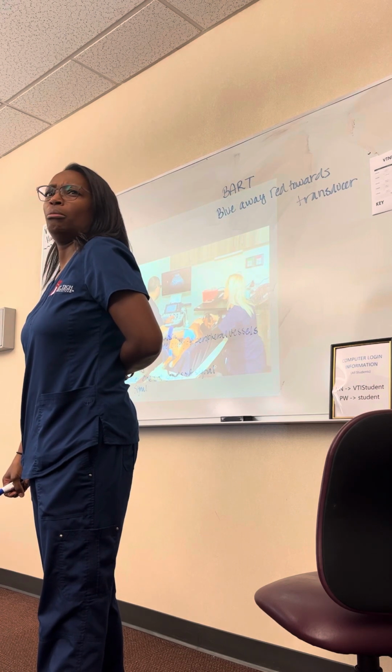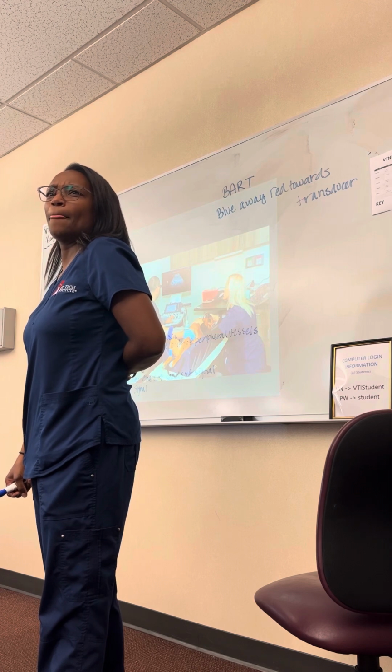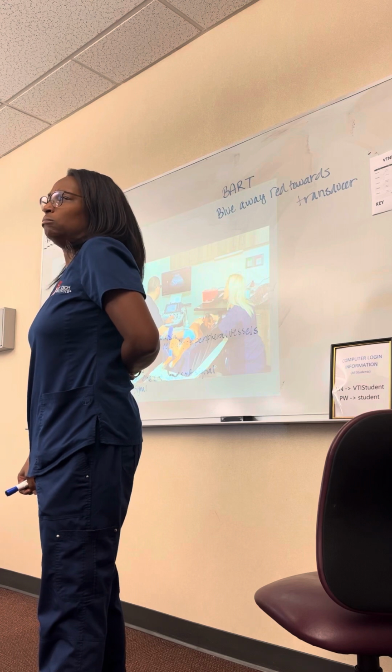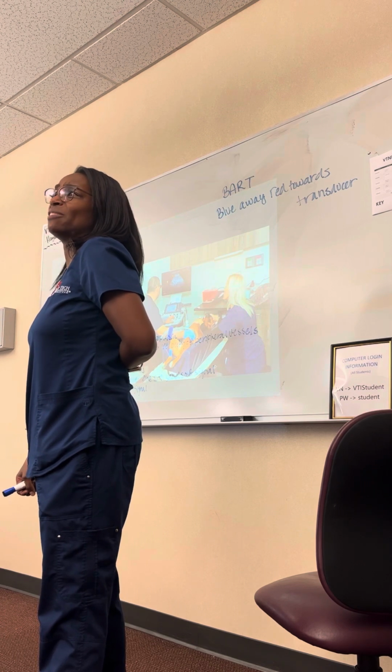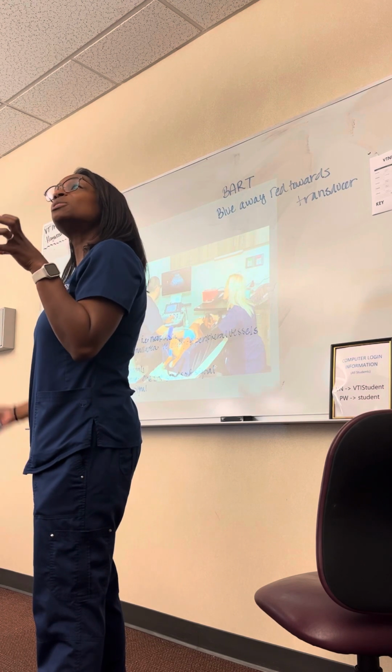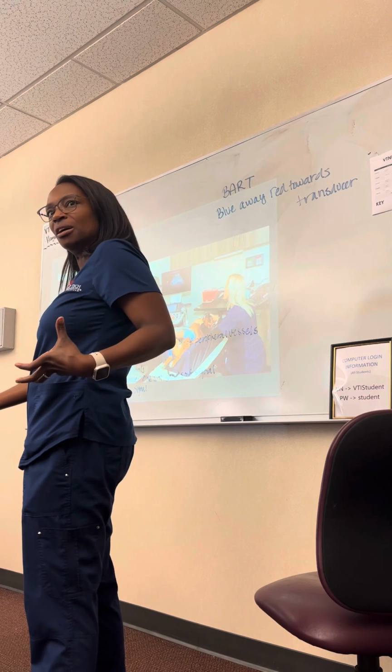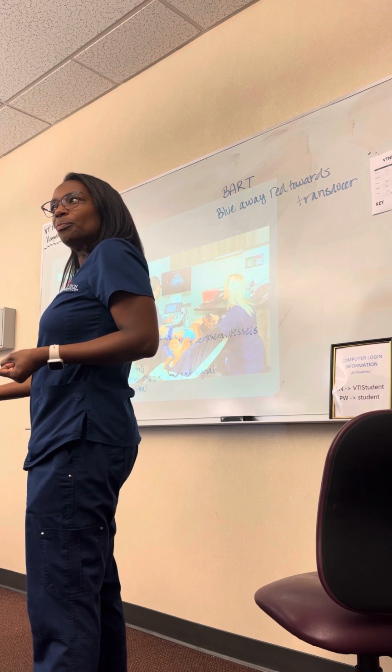Does it not have anything to do with the shape of the probe itself, and then also how you position it on the body? They weren't very specific questions. That sounds very specific. I know there are different size probes for the size of the thing you're going to be imaging, and different shape probes.